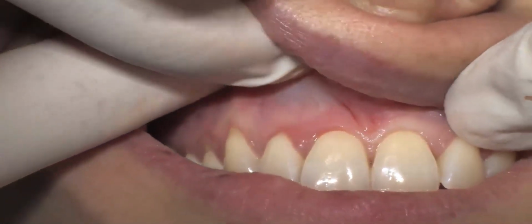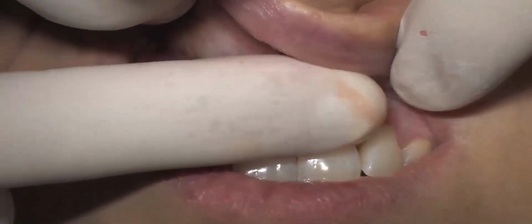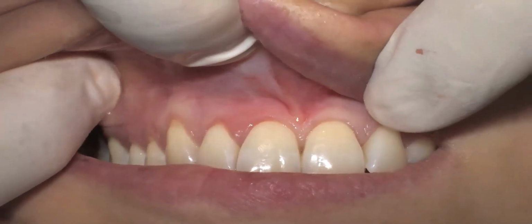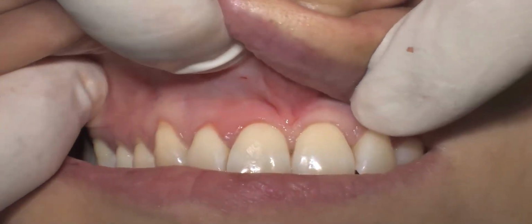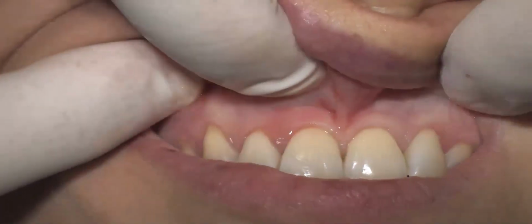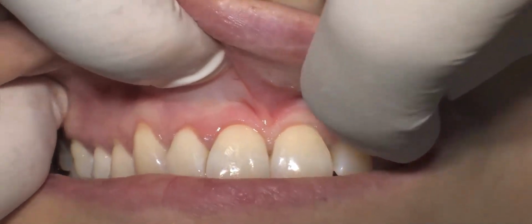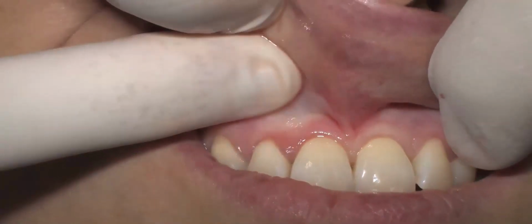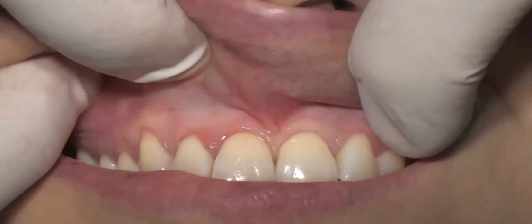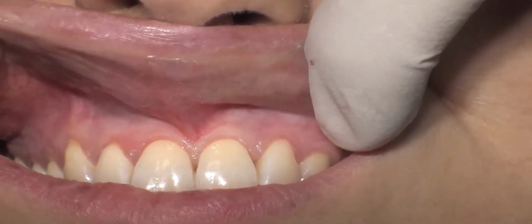We wait for the anesthesia to spread in the whole area. But you see, the pedicle, namely the most apical extension of our flap, is completely free from perforation, because I really believe that the best vascular supply comes from the pedicle. So I will never make surgery in which there is apical incision.